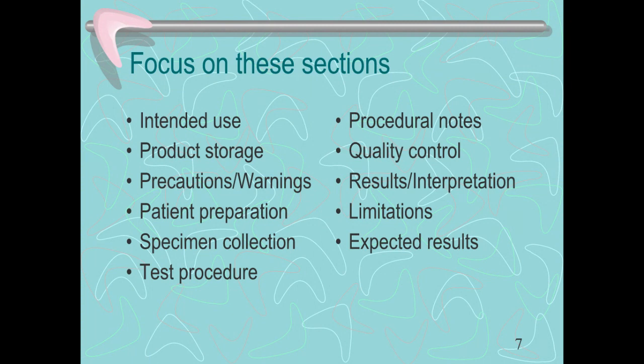What are the limitations of the result? At what point do you send that out to a reference lab for being unsure? And what would be the expected results? Should it be positive? Should it be negative? Or what happens if it has information that you are unfamiliar with, or it comes up odd compared to what it tells you? So know what the expected results should be.